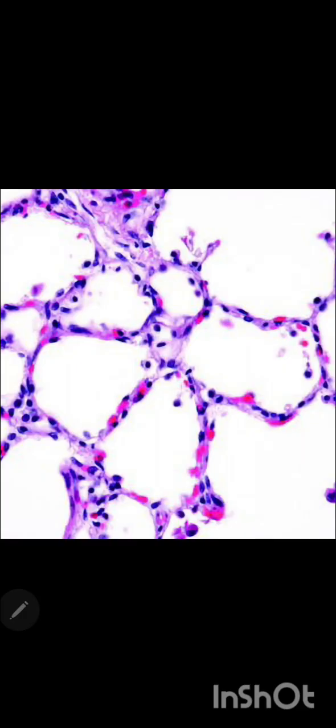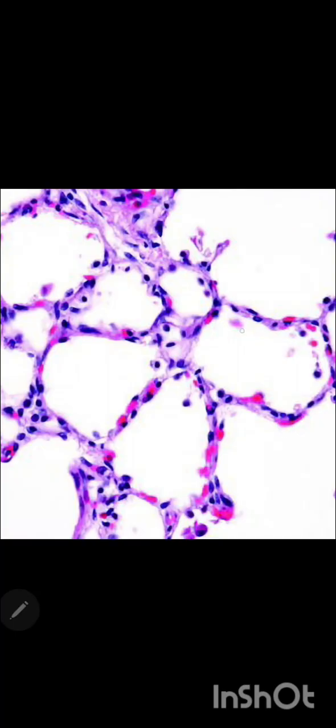And third point is the nuclei in this simple squamous epithelium, almost always present in the center, and a somewhat flattened nucleus is present in the sample tissue, because they are simple squamous flattened type of cells, so the nucleus is also somewhat flattened in shape. Hence we can identify the simple squamous epithelium: how the cells are flattened, how they form the single cell lining, present above this single basement membrane, and the nuclei are also flattened. So this type of epithelium is present in lung.